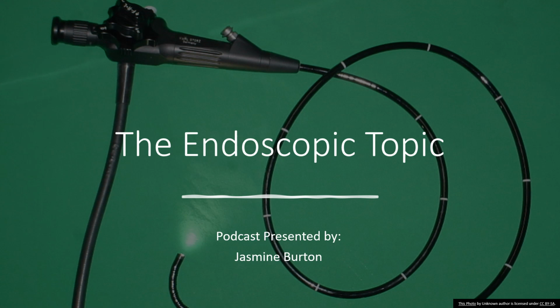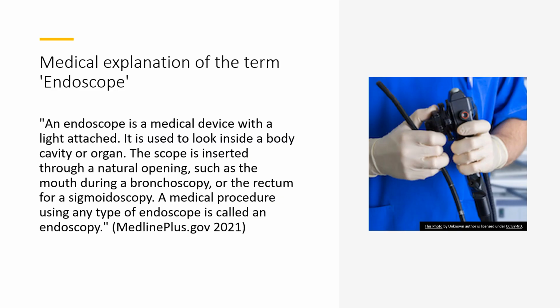My name is Jasmine, and this week we're going to be discussing endoscopes and some of those common problems that arise in healthcare facilities across the United States. Our goal here is just to educate everybody, and hopefully you can take something back to your facility with you, and we can help reduce some of those common errors that occur with endoscopes, because ultimately our goal here is that patients always have the best quality of care at all times. And ensuring that everybody has clean endoscopes is very important. All right, let's go ahead and get started.